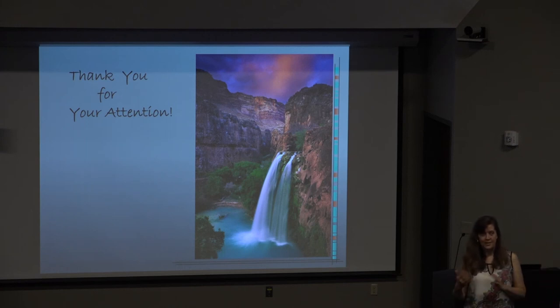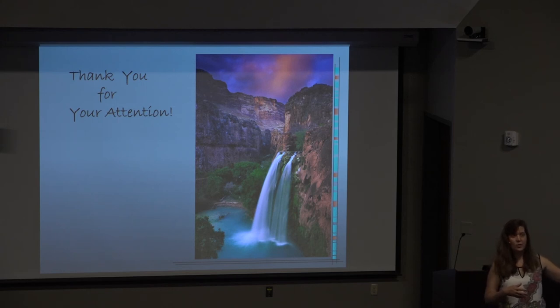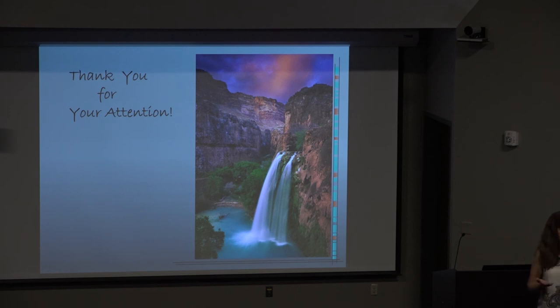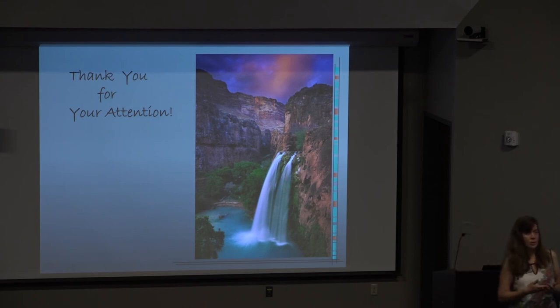And those are the signs you're looking for to diagnose accreta and increta. Percreta is a little different because you actually see the placenta outside of the uterus. So percretas are not as tough for us, although some might differ in opinion. But I think the accretas and the incretas are very hard. And I personally, accreta, if it's a mild accreta, you may not see anything, right? So our sensitivity for accreta is not very good. For increta, it's pretty good. And for percreta, it's, I would say, the best.